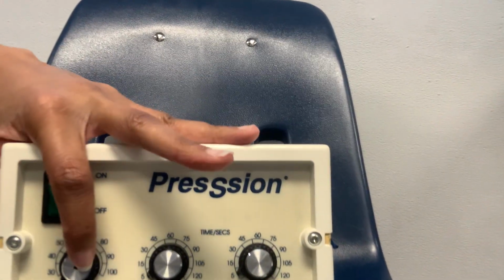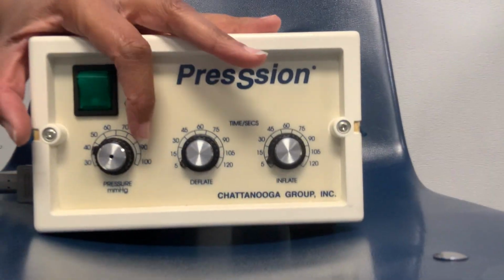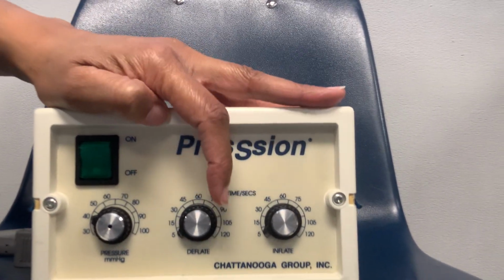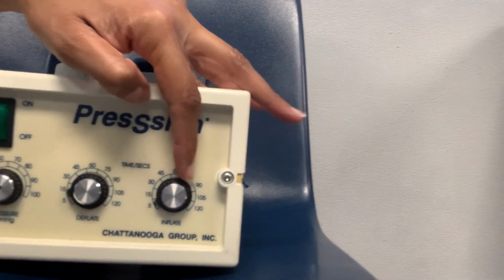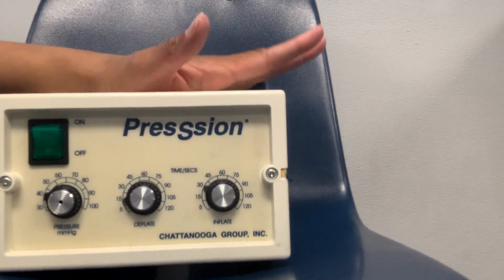But to set my inflation pressure, I'm treating the lower extremity. So I'm going to set it to 40 millimeters of mercury. My off time, so remember we want a 3-to-1 ratio. So my off time is going to actually be 10 seconds off. So I'll set it to 10 seconds there. And then 30 seconds on for my inflation pressure. And then my machine is set.